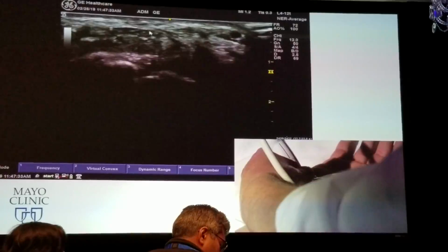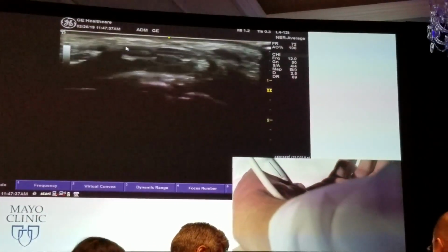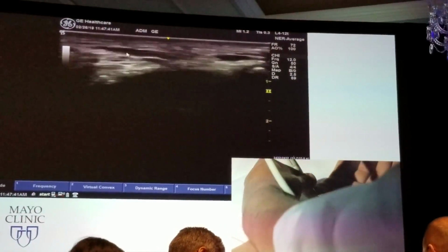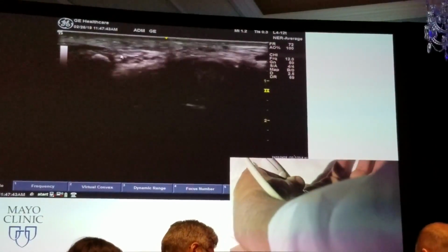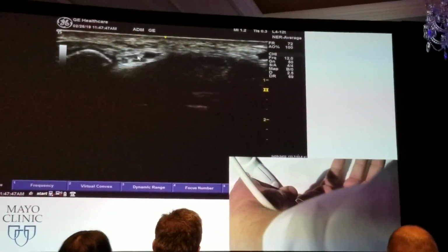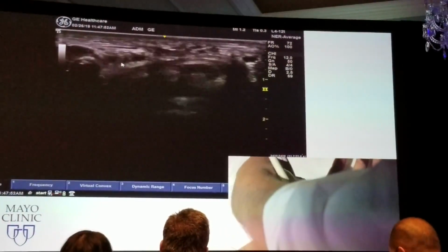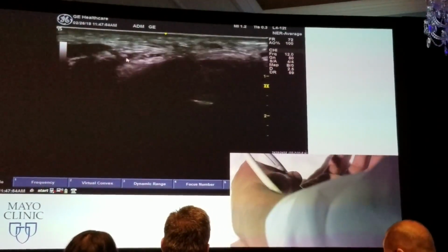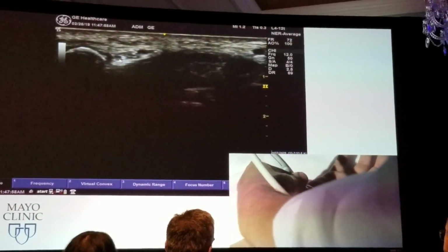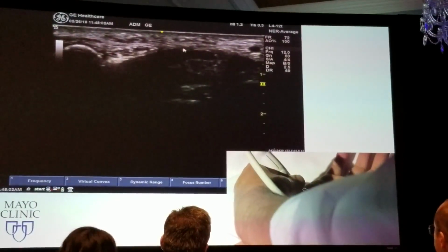So I know now that this is the nerve, and I know in particular this is the median. If I go back over here by this artery, back to the pisiform bone, I'll get myself oriented here. Here's the pisiform bone right there. Here's that artery again. And this structure right here, if I rock it, has an intermediate anisotropy. So this structure right here is the ulnar nerve. And so here's the retinaculum and the carpal tunnel right here over the top.